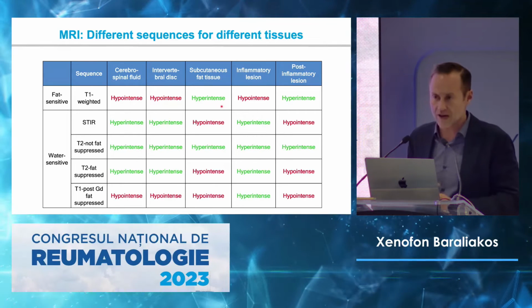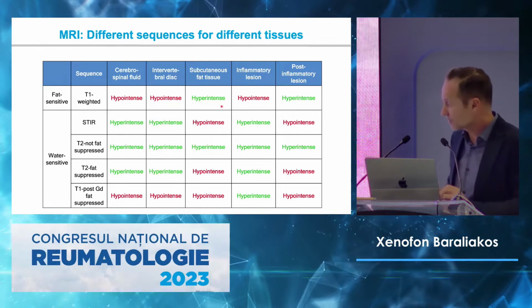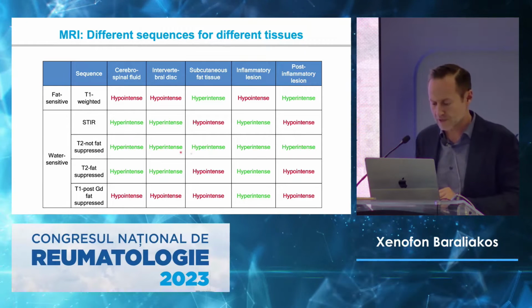And there is a lot of other information you can get from those MRIs. And what you can see is that, in fact, plain T2 images do not really help us because they're all white.